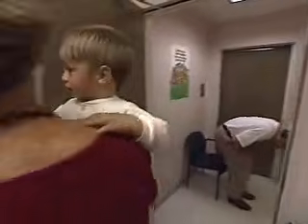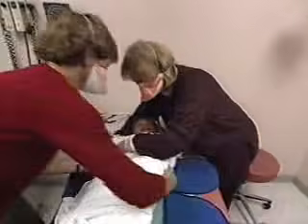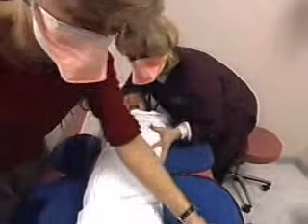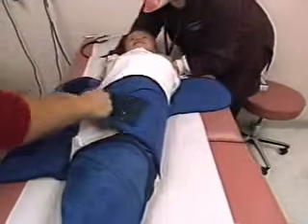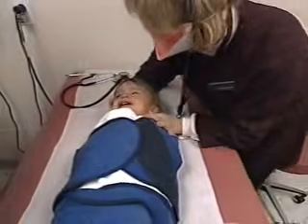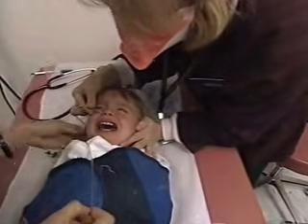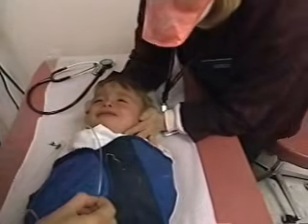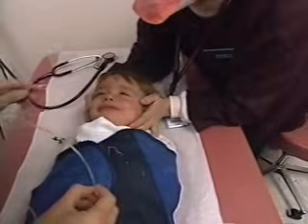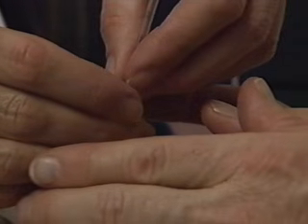Encourage the parent to wait in the waiting room. Immobilize the child with a sheet and papoose board. Measure the expected distance from the nose to the stomach and mark this spot on the tube with your pen. Moisten the tube in the child's mouth — I like to avoid bacteriostatic lubricants. Insert the tube into the nose, staying away from the septum and aiming directly perpendicular to the bed as you advance the tube.